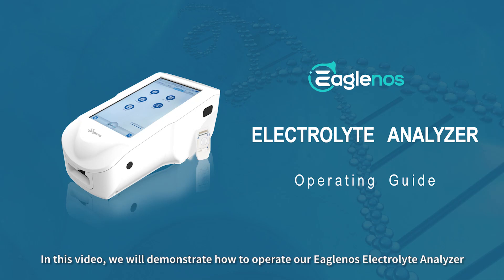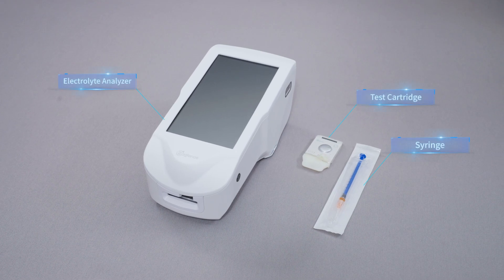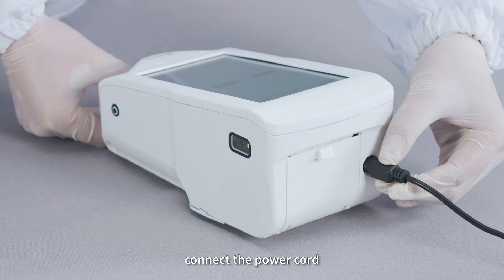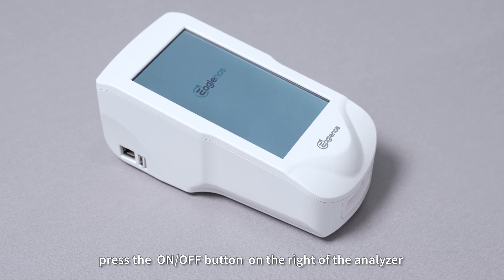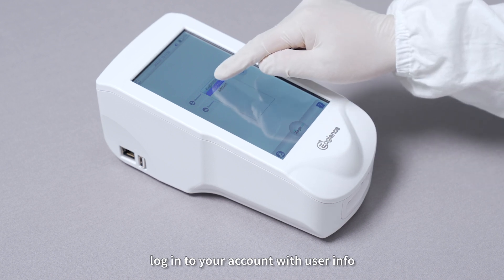In this video, we will demonstrate how to operate our Eaglenos Electrolyte Analyzer. Connect the power cord. Step 1: User Login. Press the ON-OFF button on the right of the analyzer to turn on the analyzer. Login to your account with user info.